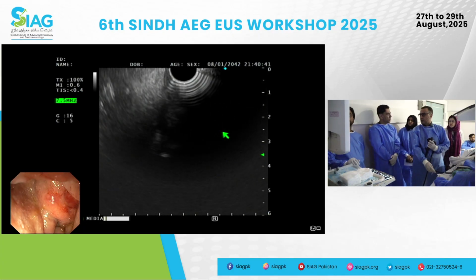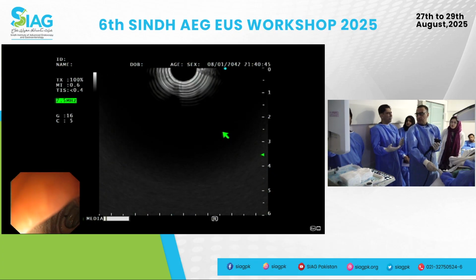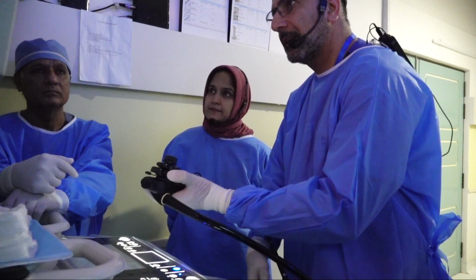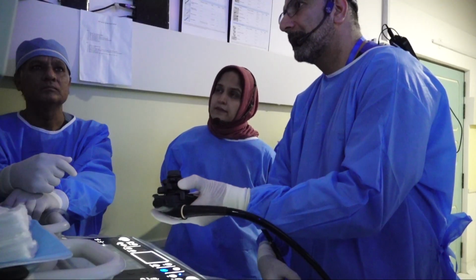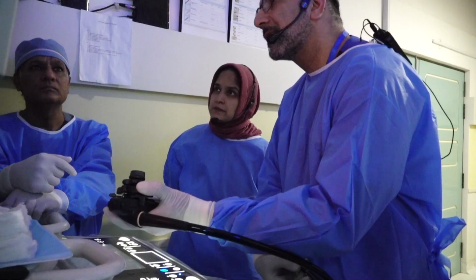Do you want to say anything else, Mustafa? Should we see D2 again? Can we go to the other room? Very happy with that. I think it's fine. We can see that. Yeah, let's just go clockwise. Oh, good. Nadeem has made a good point. Very nice. There's some echogenic shadowing, and I'm going to go clockwise to see if I can see the PD.